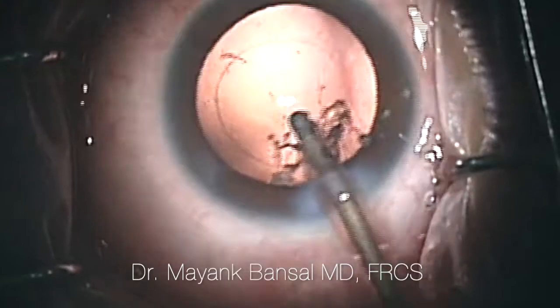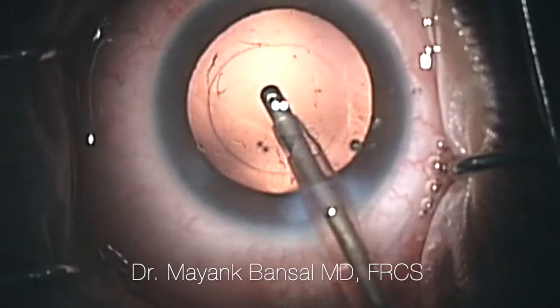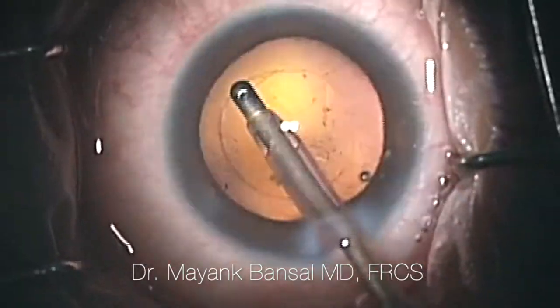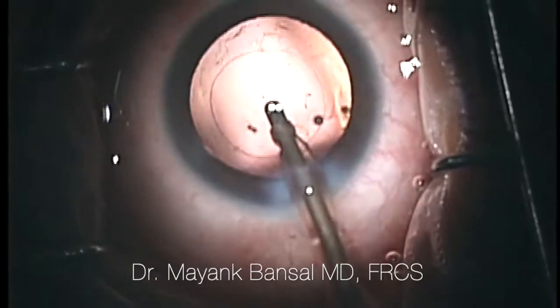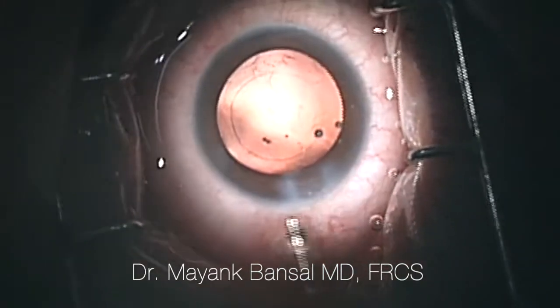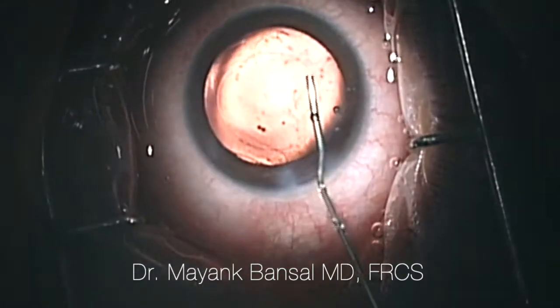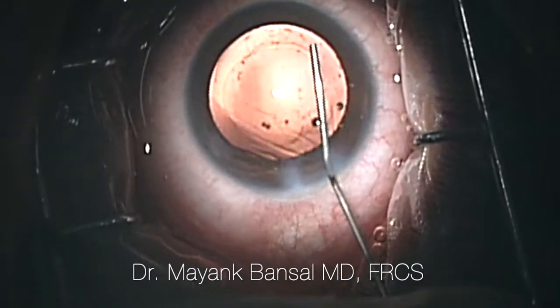Taking care not to aspirate all of the cortical matter and not to cause an opening in the posterior capsule, we're able to aspirate all of this. At the end of it, we do a polish to remove all of the lens fibers. With this done, most of our cataract surgery is towards the end, and now it's time to implant the intraocular lens.